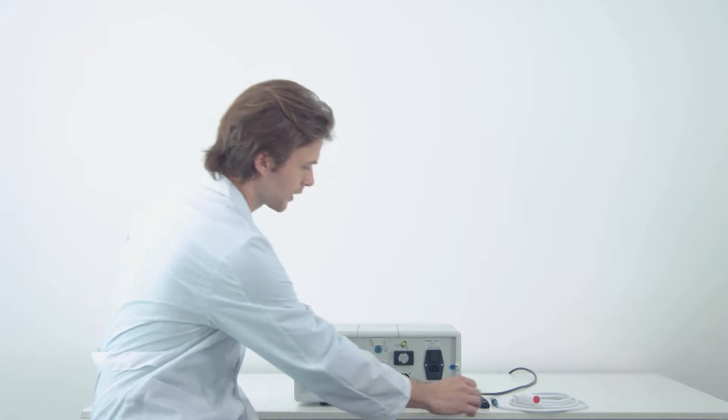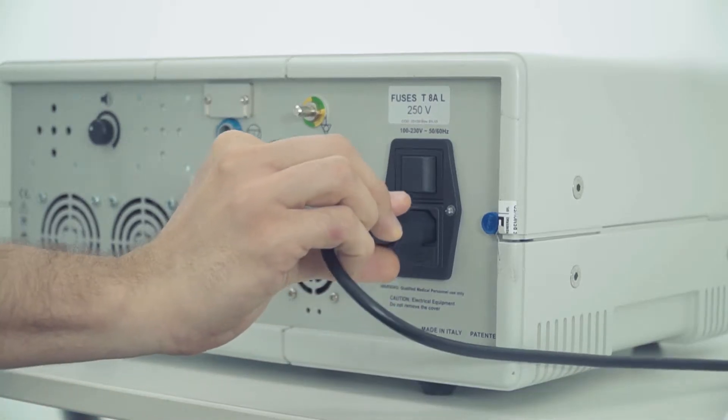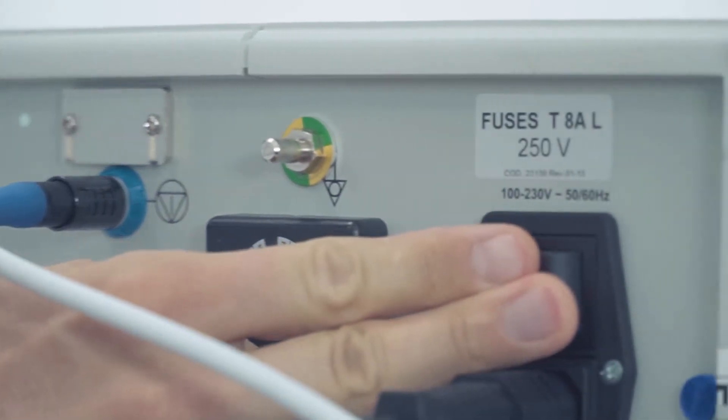In the rear panel, connect the power cable. Connect the safety button cable and switch on the device.